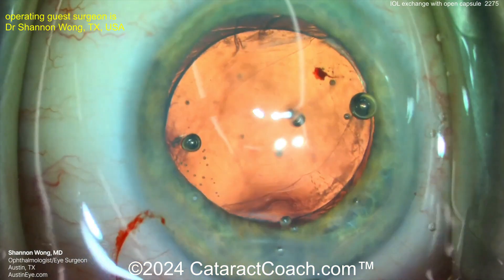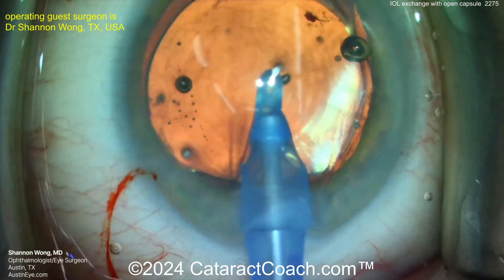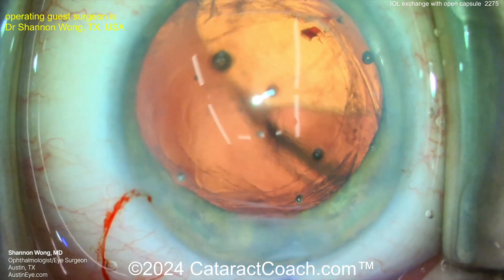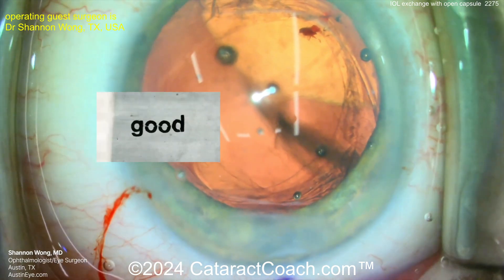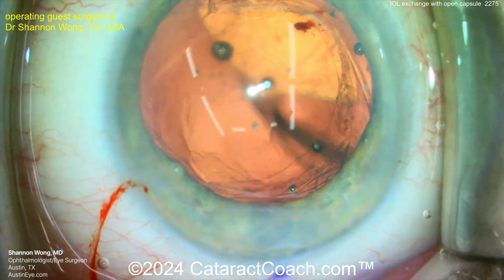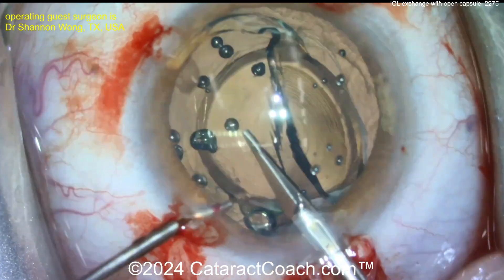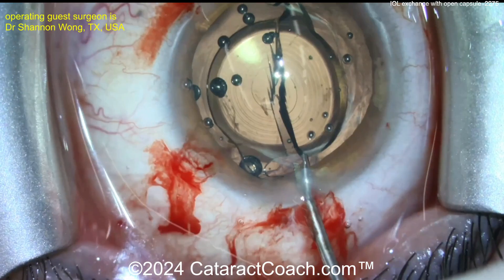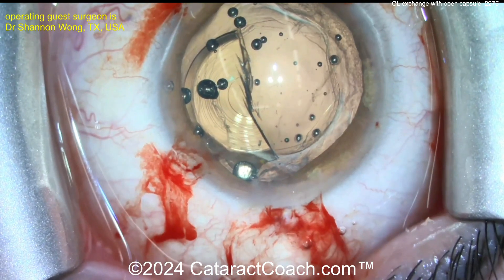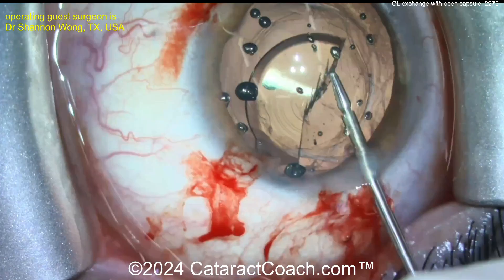In another case, watch out — you can see that lens falling back, back, back into the vitreous cavity. You've got to be careful here. This is an important complication to be aware of when exchanging lenses with an open capsule.